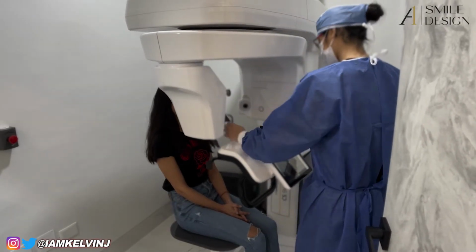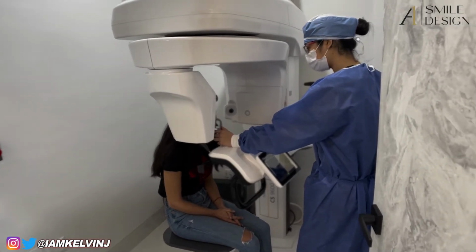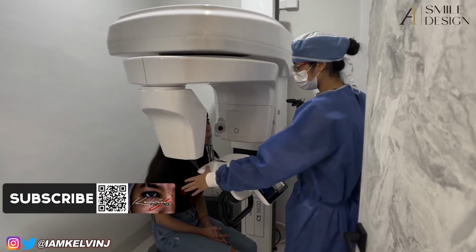Now we're going to take the bite around. So, I need to turn your chin here and bite. Right. That's a round. Okay. And two.